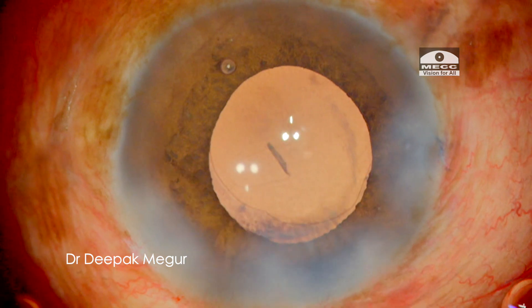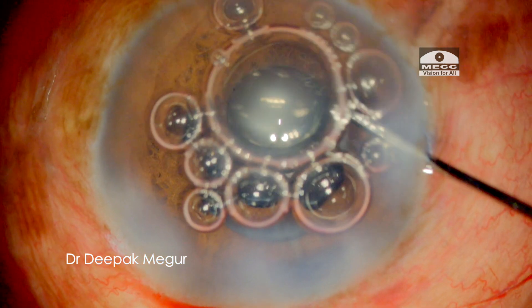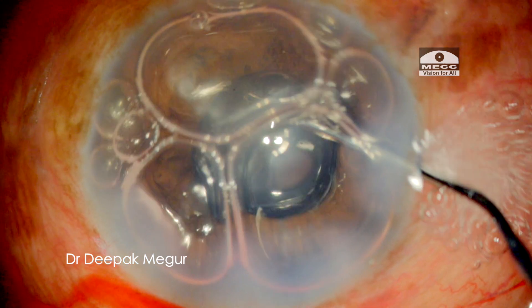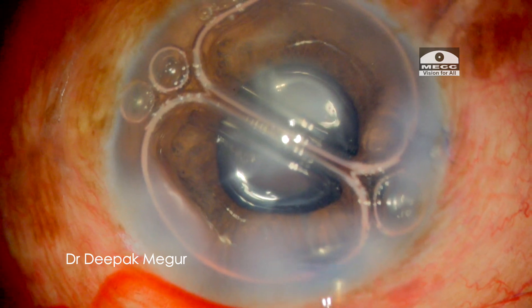At this point, I am seeing a small Descemet's membrane detachment, probably because of the increased maneuvering in the anterior chamber. To support it, I am putting an air bubble to provide a temporary tamponade.